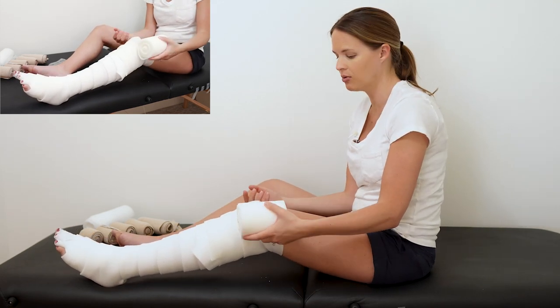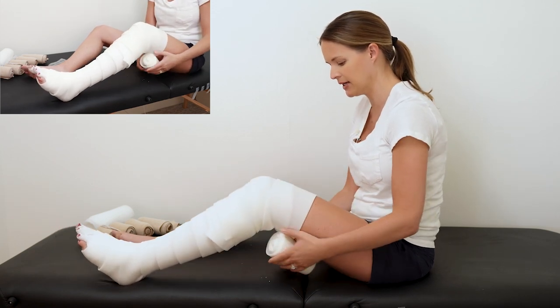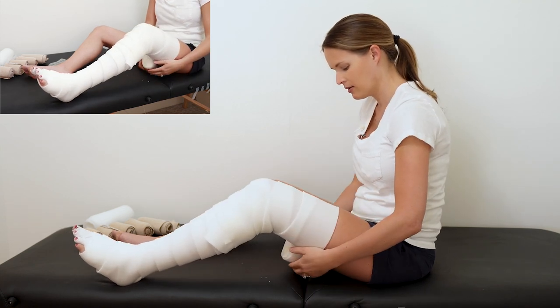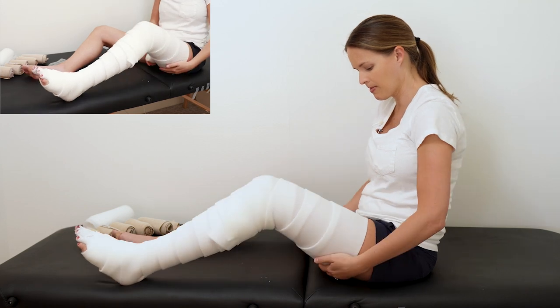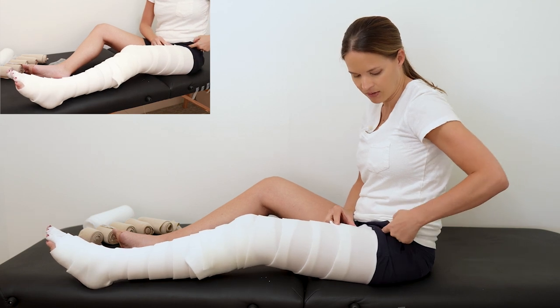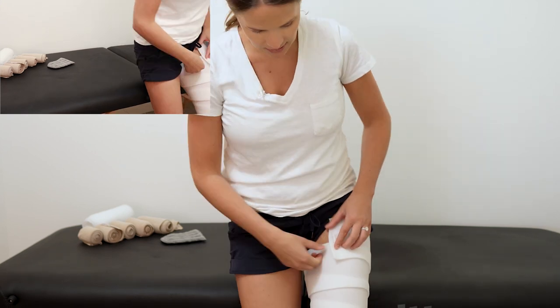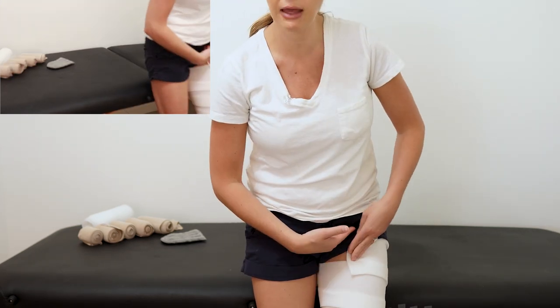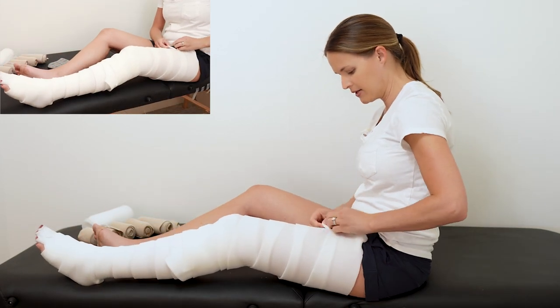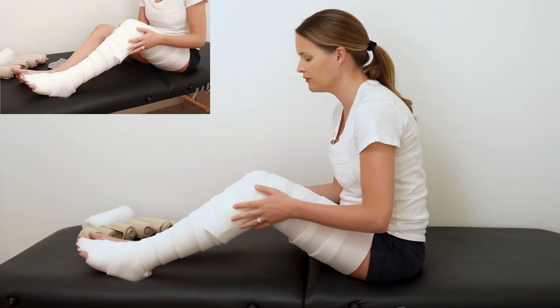This is actually easier to do in standing at this point. If you can't stand, you can do it sitting. Put a little cotton behind the knee, then use tape to help keep everything in place as you continue the foam up. Then we're going to move on to the bandages themselves — have your tape ready. Masking tape works great; there are also some medical tapes that are wonderful.